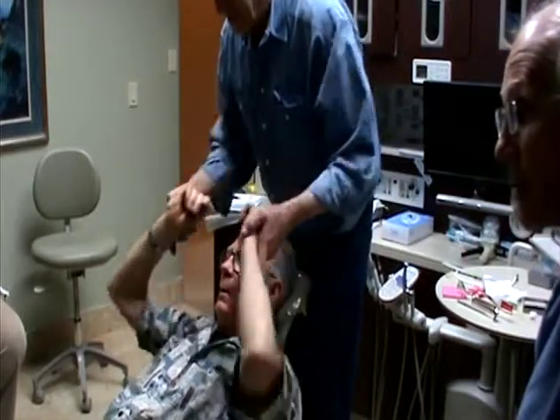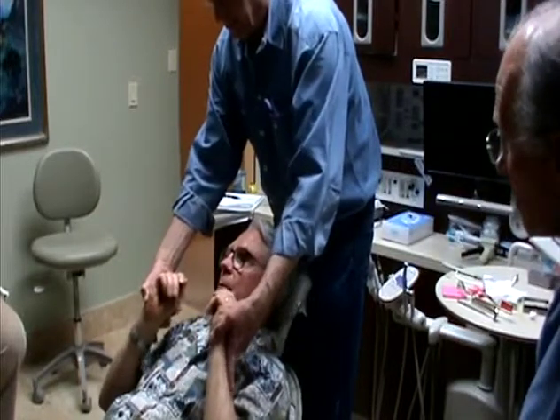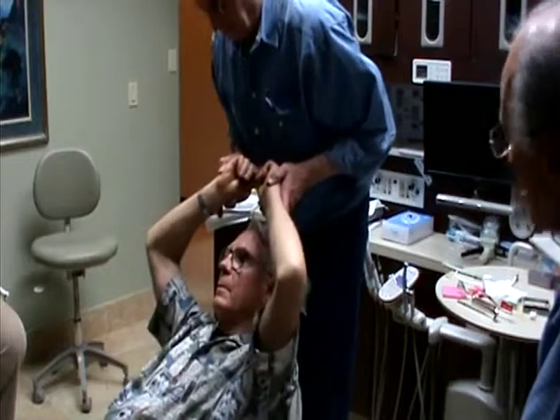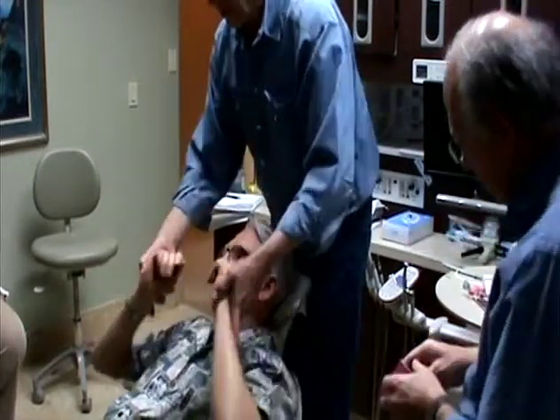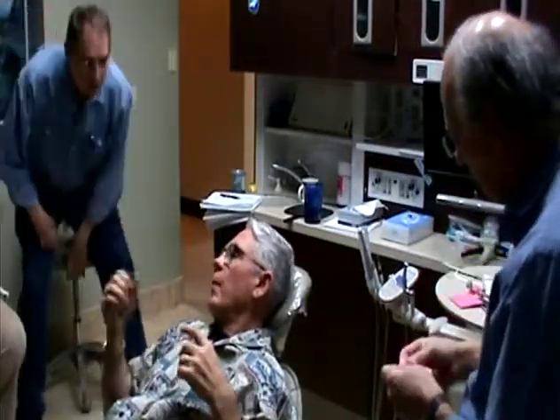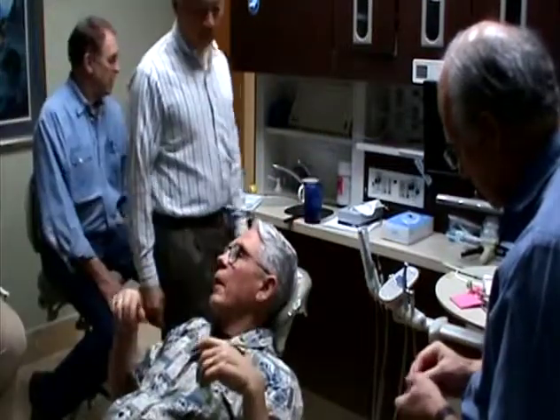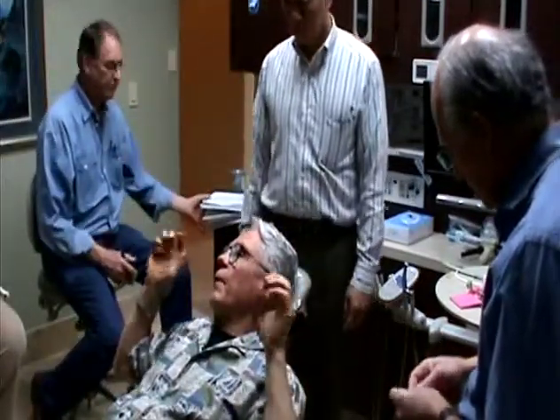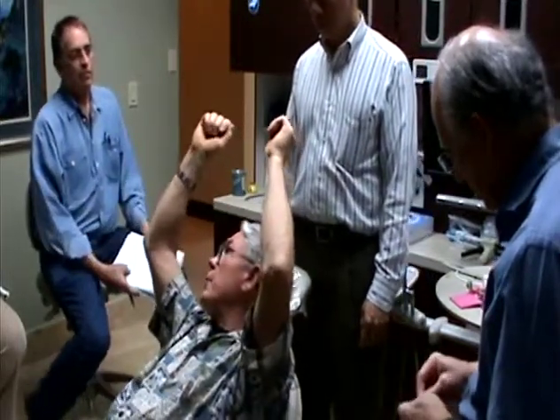Okay, let's have you close and bite down, please. More like that. That's all you gotta do, because if there's a problem with one of these arms, usually the right arm, you'll feel it right away. You don't have to pull way back here to feel it. You gotta keep in a relaxed position and feel that tension. If you've got me pulled back, you're not feeling the tension, you're changing it.